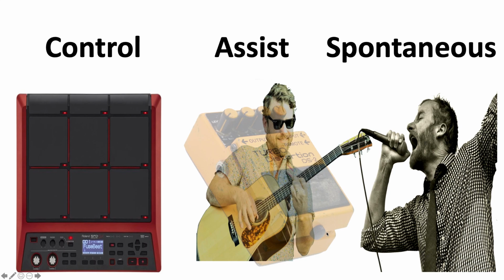Now, to put this in the music perspective, for the control breath, that's kind of like a beat generator or a drum machine. You set the rhythm you want, you set the tempo and all the different components, you press play, and the machine just goes. All right? So just like a ventilator, it just goes and gives the breaths that you set.